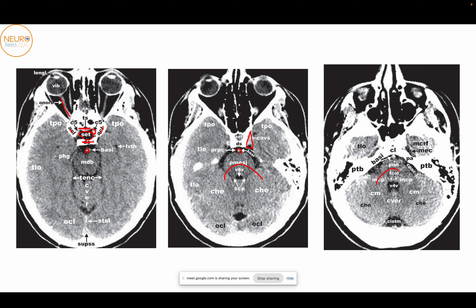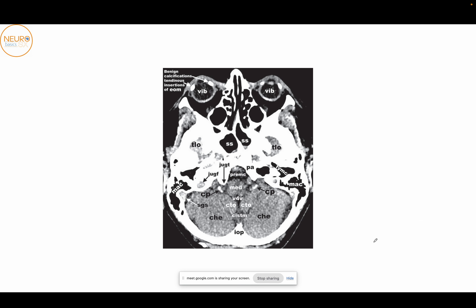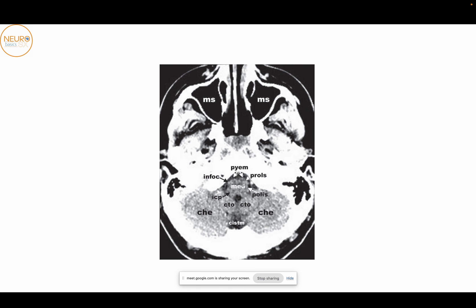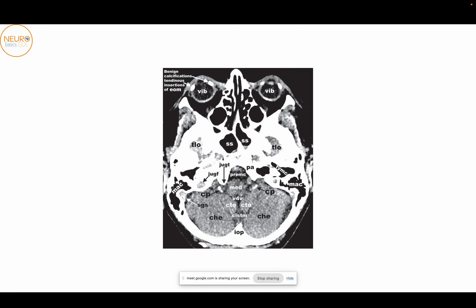As we go further down, the pons becomes more obvious. You can clearly make out the petrous body and the petrous apex, which connects with the clival bone. Anteriorly to the clivus will be the sphenoid sinus. There's a slightly hypodense structure at the level of the petrous apex — that would be Meckel's cave. The pons turns into the medulla. The fourth ventricle is ending here, and on either side of the fourth ventricle, you have the tonsils, behind which you have the cisterna magna. Sometimes in older patients you can develop calcifications at the insertions of the extraocular muscles — these are benign and quite normal.